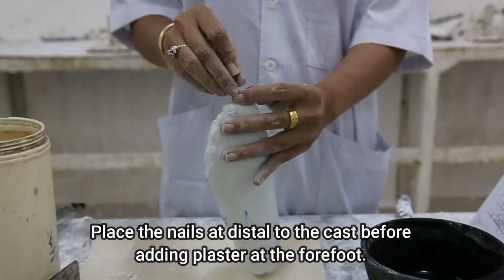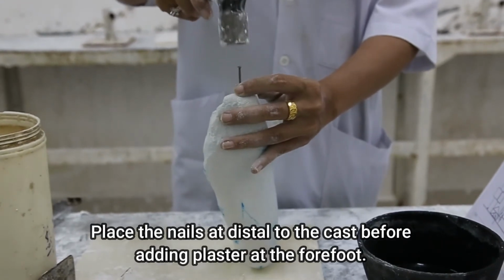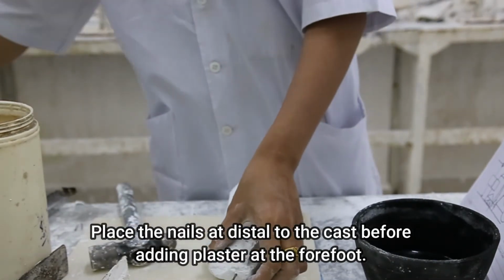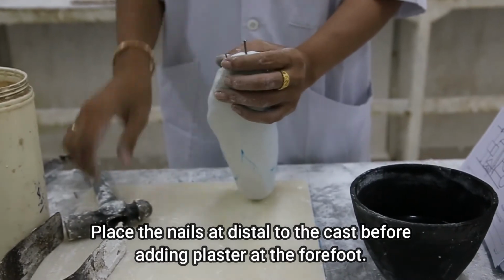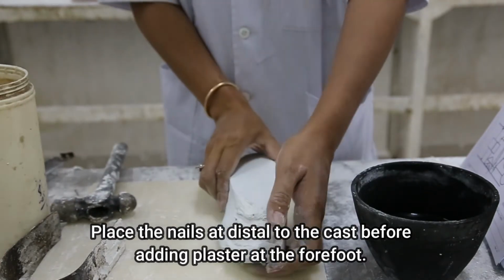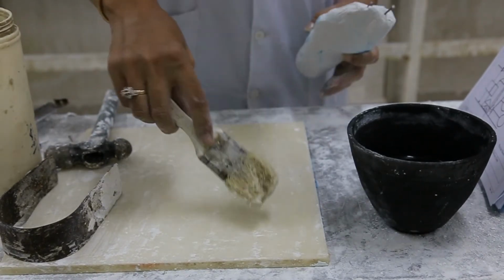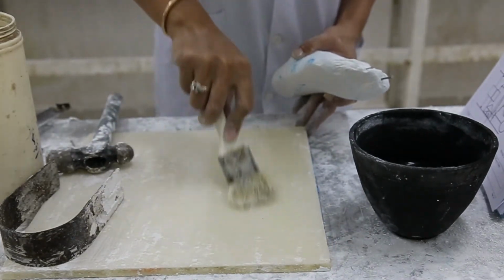So for me, I put 2 centimeters. Later on, I'm going to apply Vaseline on the plate here, to make it easy to remove the mold from this plastic.